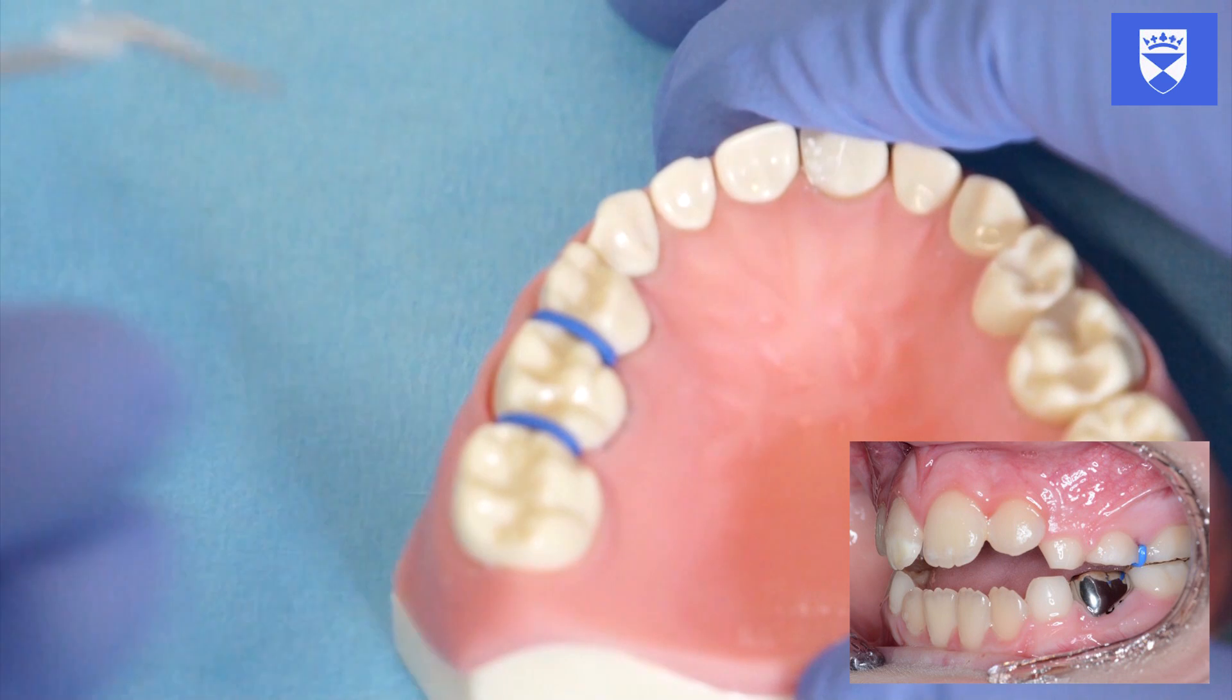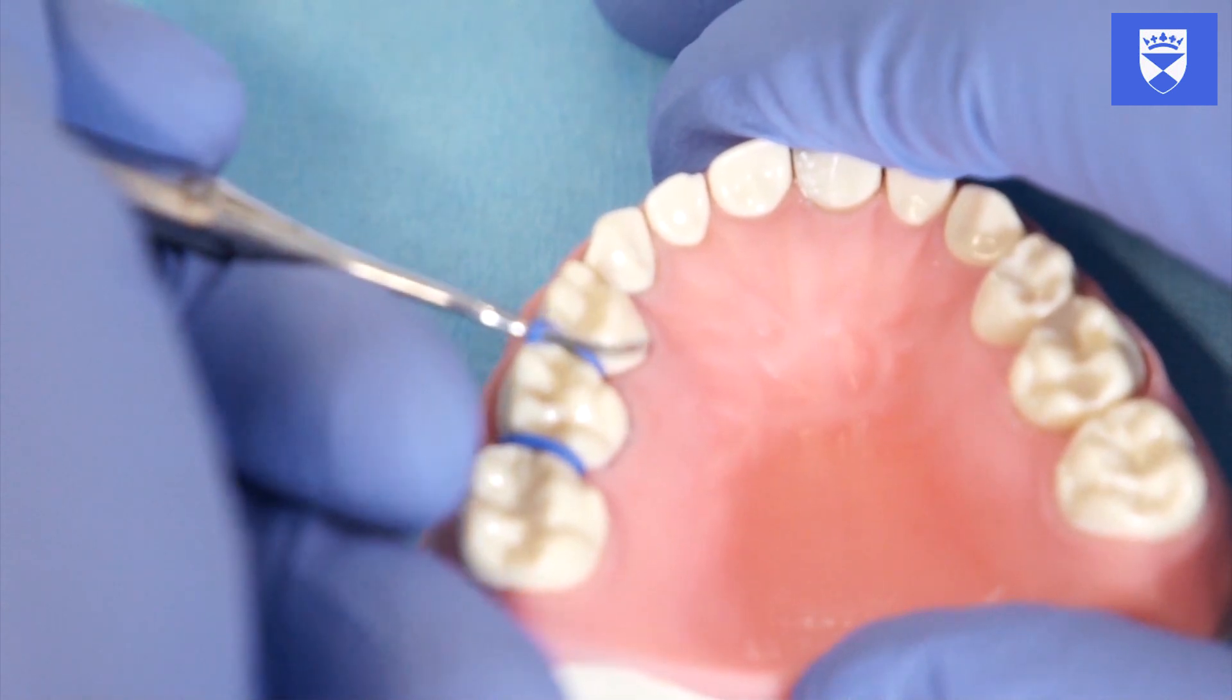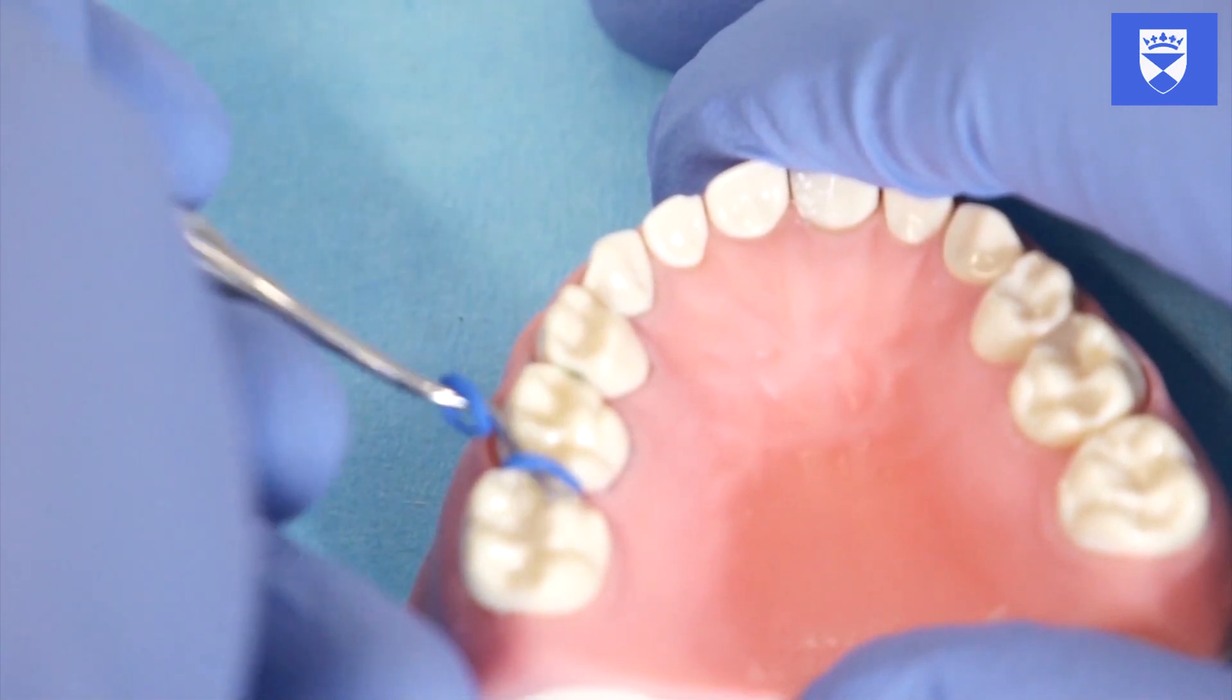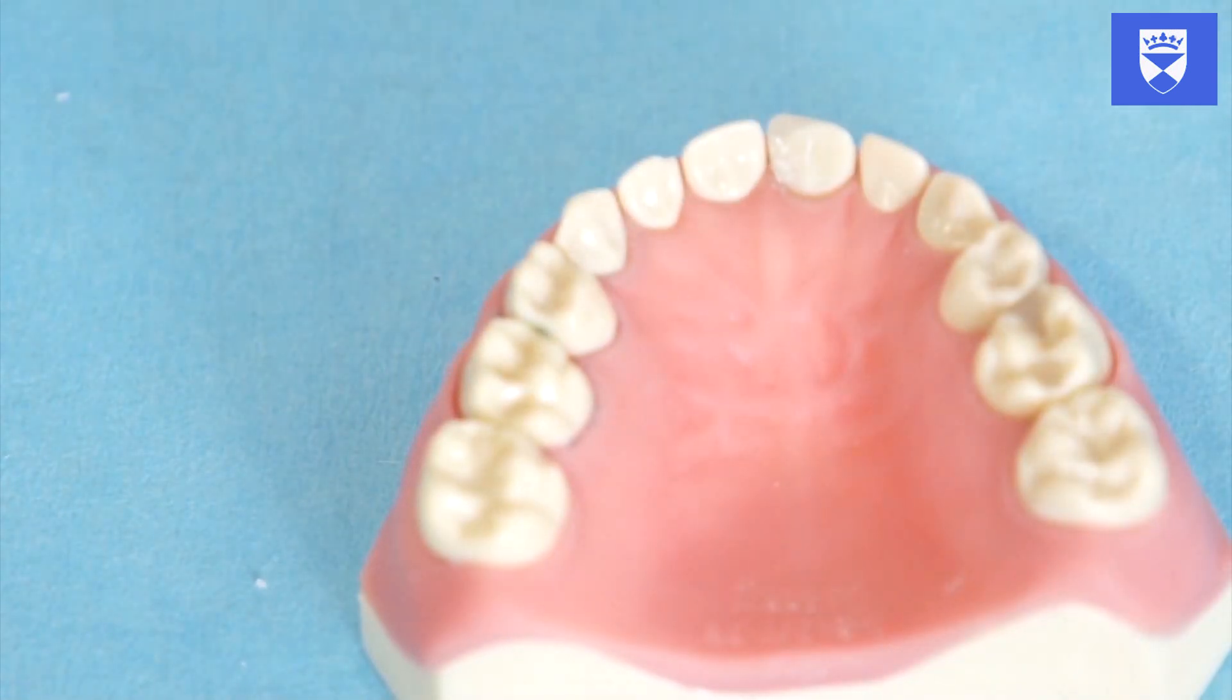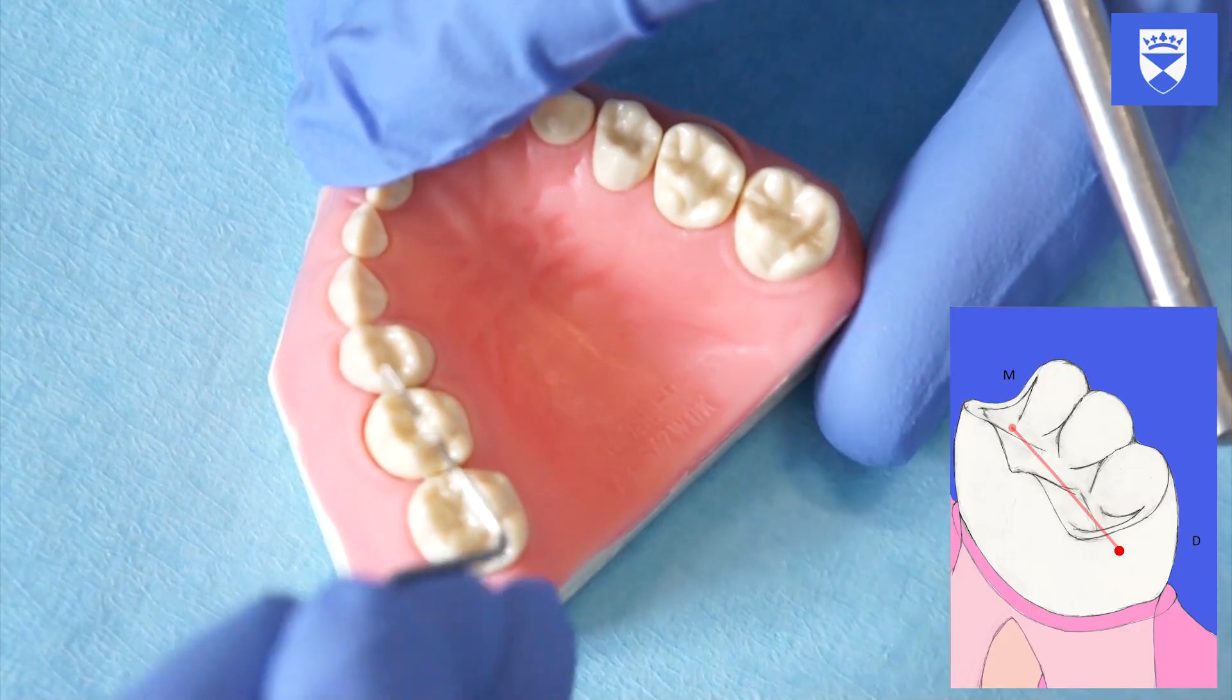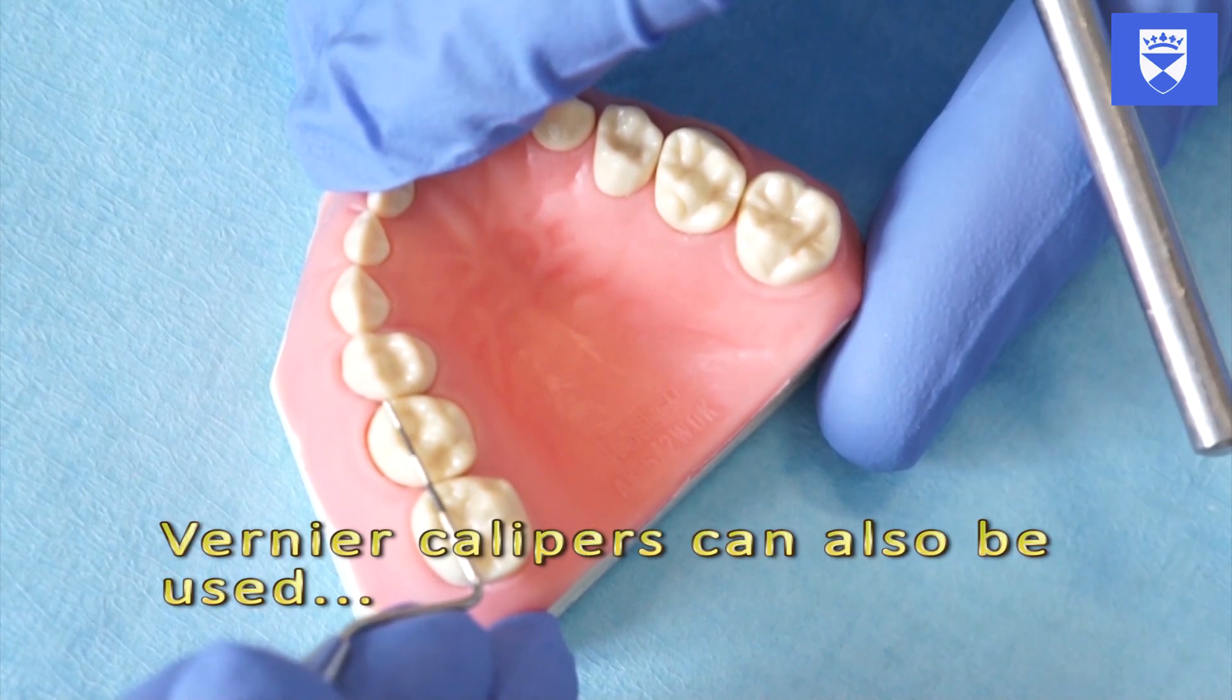Gently remove the separators. Assess whether enough space has been created to allow crown placement. Measure the mesiodistal width of the tooth to be crowned. This can be done using a number of measuring devices. A periodontal probe is effective.